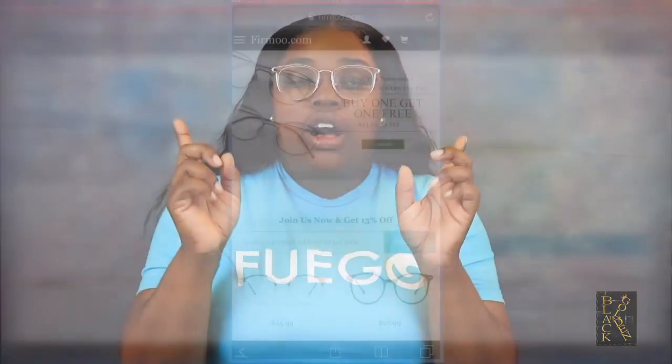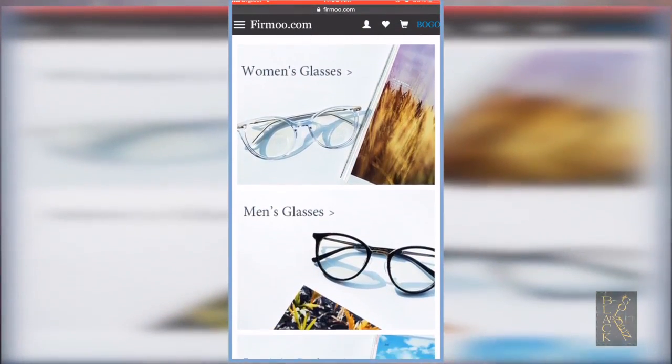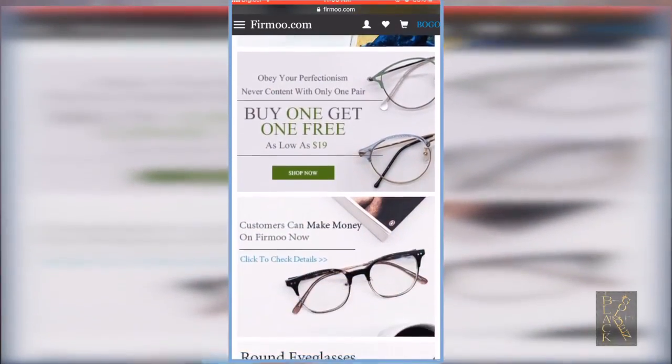No more than $39. Just in case you guys didn't realize, the glasses I'm wearing now are new and they're from Firmoo. These were my first choice — I saw them on YouTube. I was watching a review on glasses and a Firmoo review came up in the tab at the side, and I saw something like this and I was hooked.